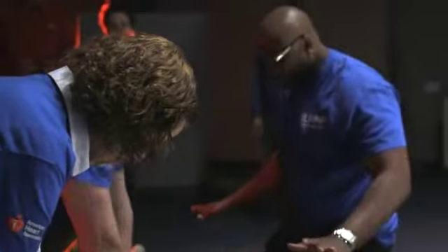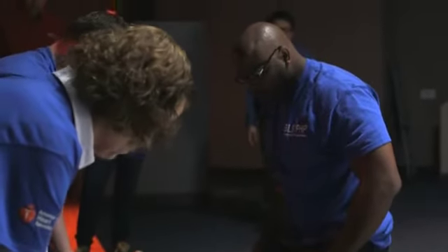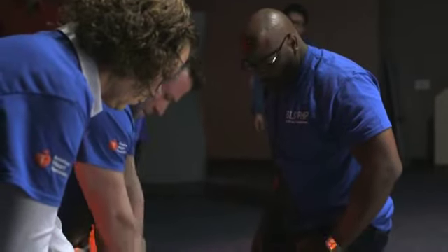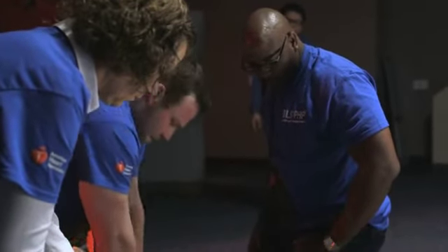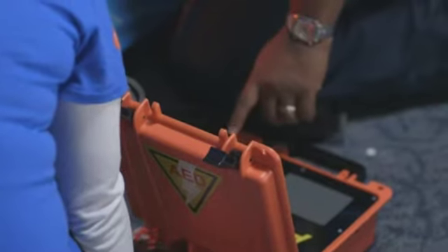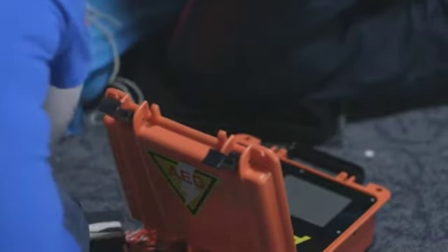Analyzing heart rhythm — stay clear, do not touch the patient. Shock advised. Charging. Stay clear of patient. Deliver shock now — press the orange button now. Shock delivered. Begin CPR.